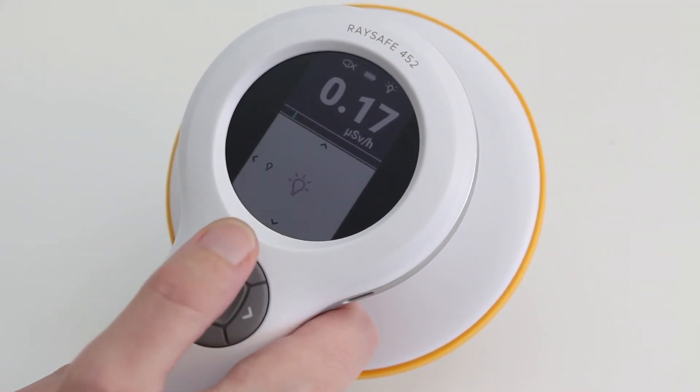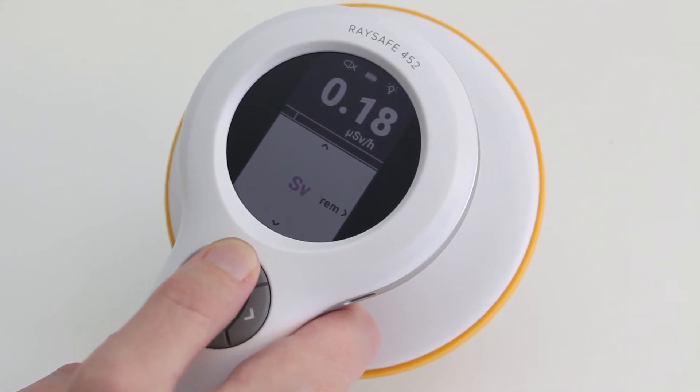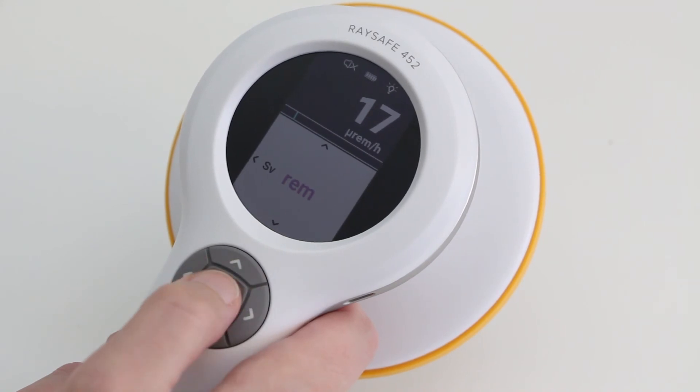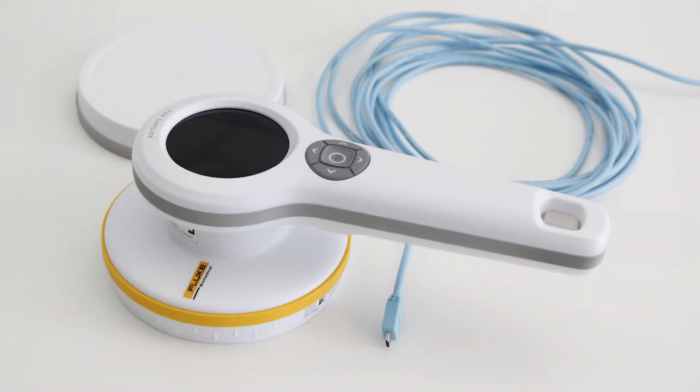Same here with the unit settings — press the up button three times. I change from Sievert to Rem. When you're done with your measurements, be sure to store the instrument with the lid on for protection.